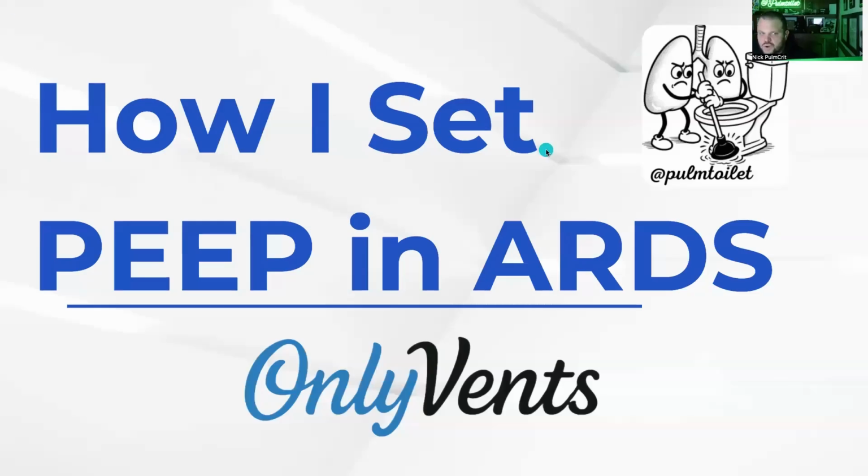Nice. Okay. So how I set PEEP in ARDS, I'm not going to go into the specifics of the literature, only where it's pertinent. Not really going to spend too much time on the nuts and bolts. I'm just going to assume you sort of know that, and this is my approach to it. Unfortunately, I think all of the guidelines, at least from ATS and the European Society, just say high PEEP. So what is high PEEP exactly?